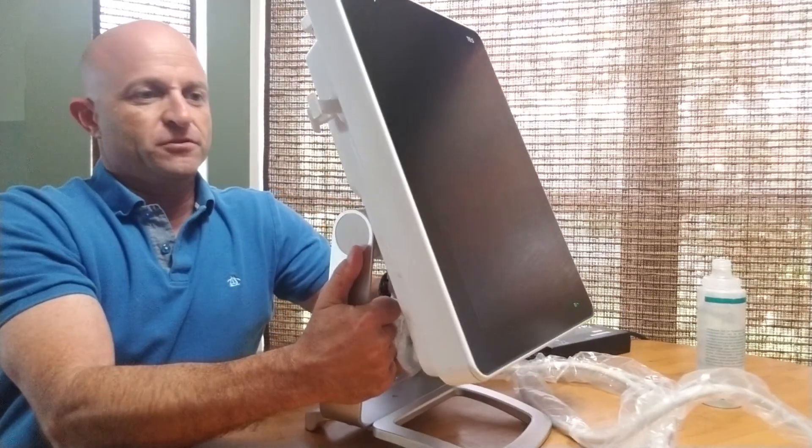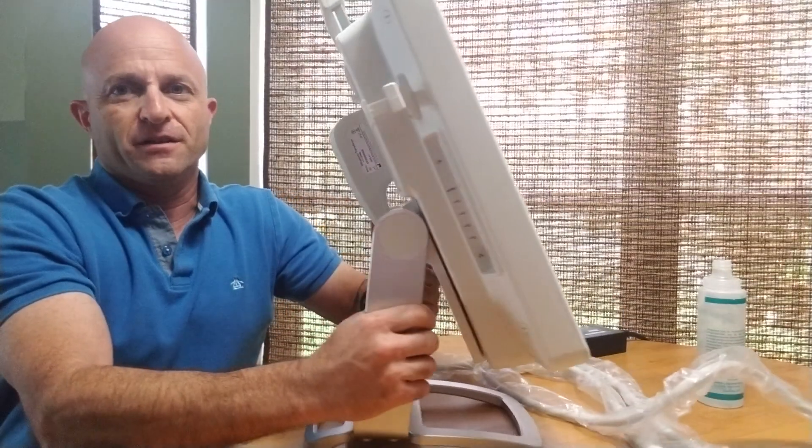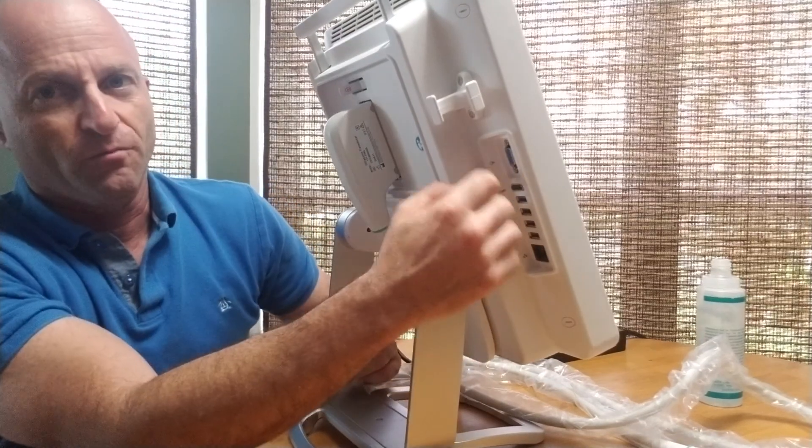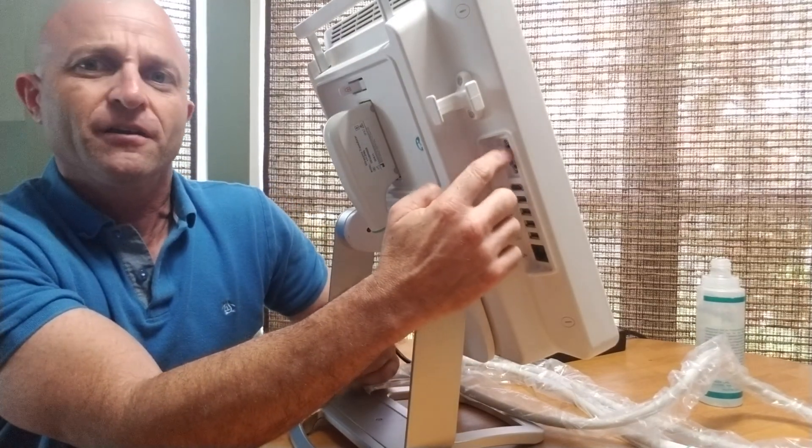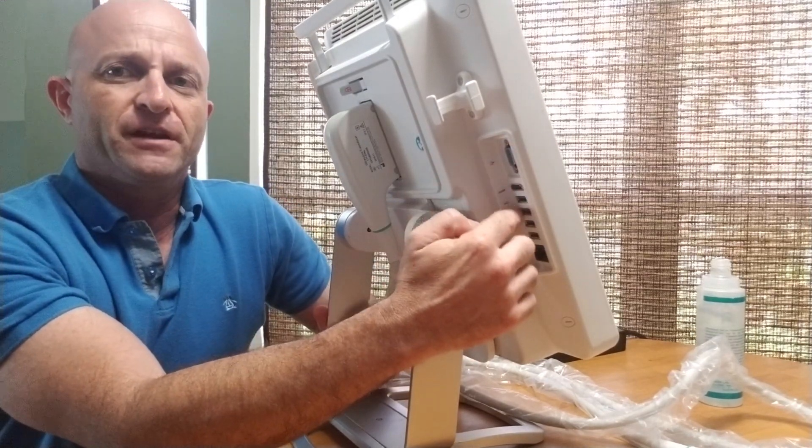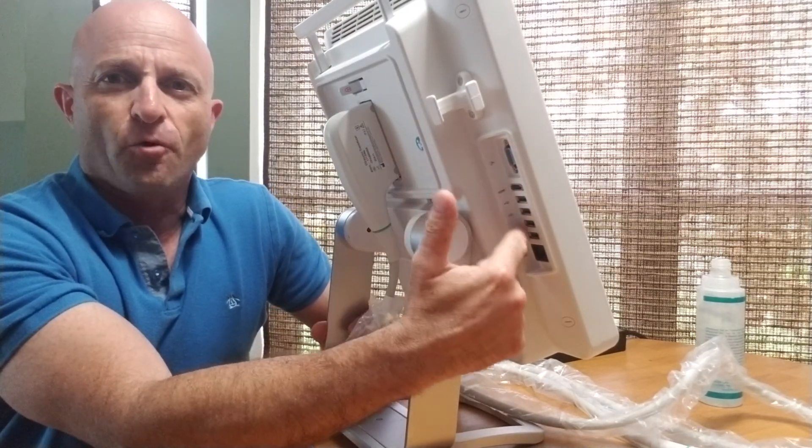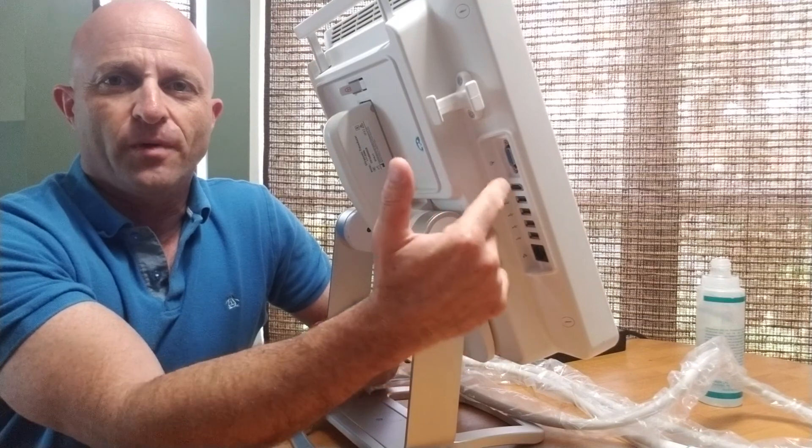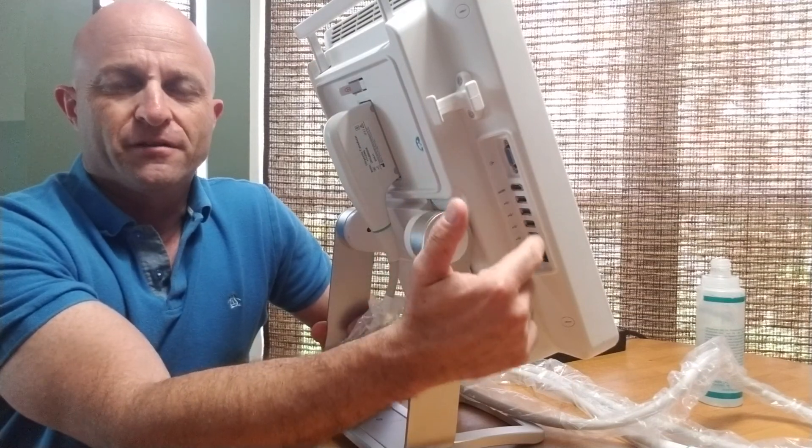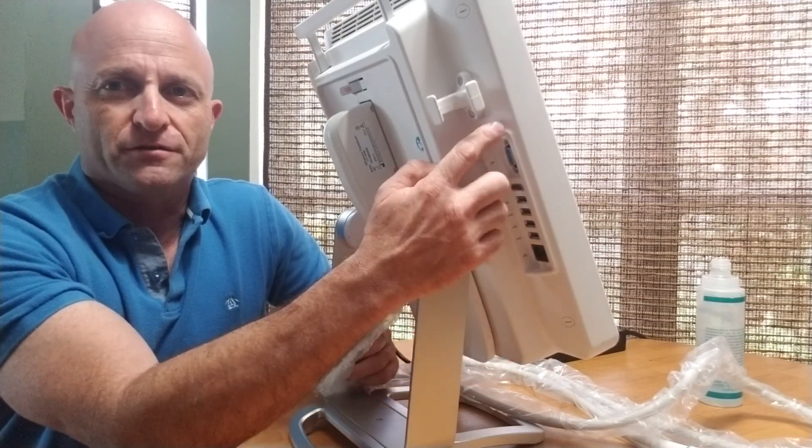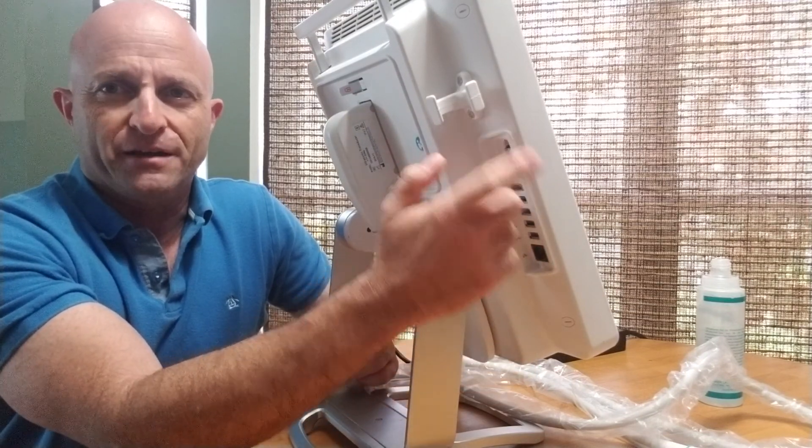If we rotate to the back side of the system, you'll see the various port connectors. There are four USB ports, an HDMI, a network port, and a VGA.